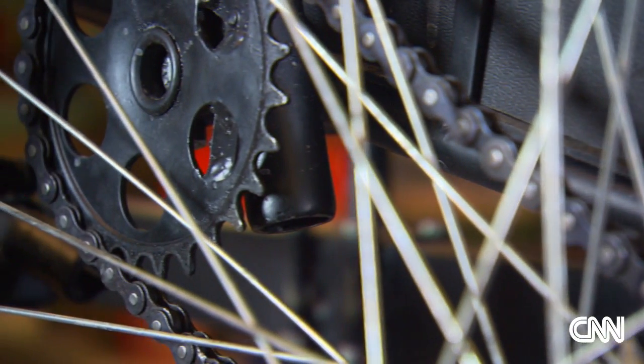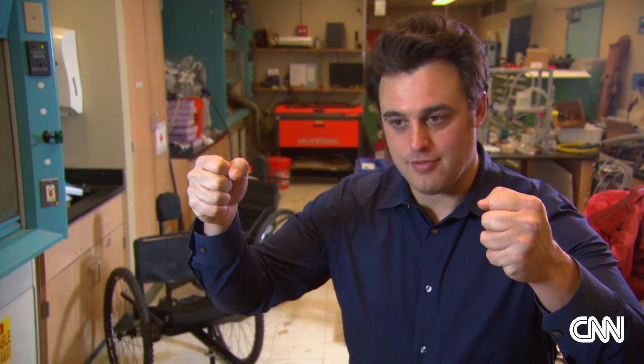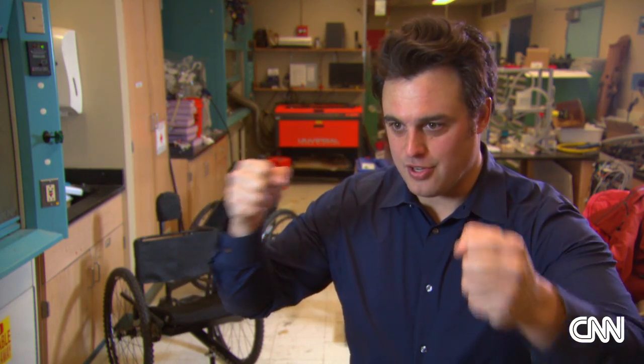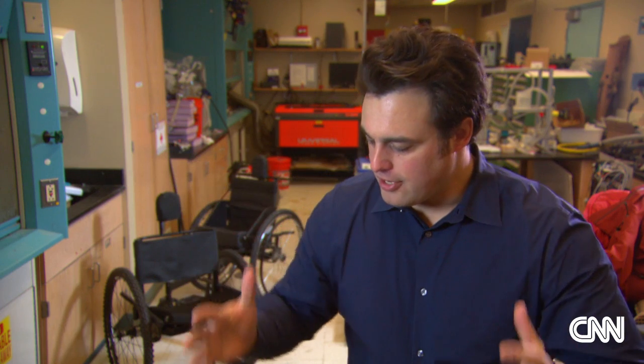Built primarily of bicycle parts, it has a gearbox controlled by the ultimate in manual transmissions — human hands. If you grab high on the levers, that gives you an effective low gear, so you can pump your way through sand or mud or up a steep hill.